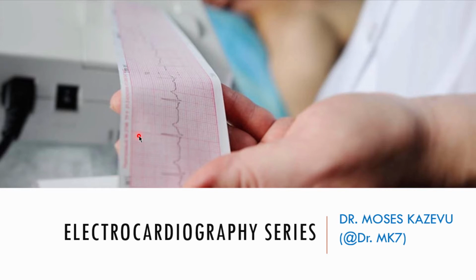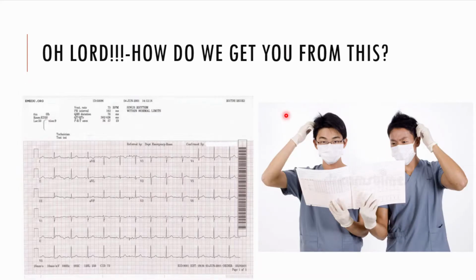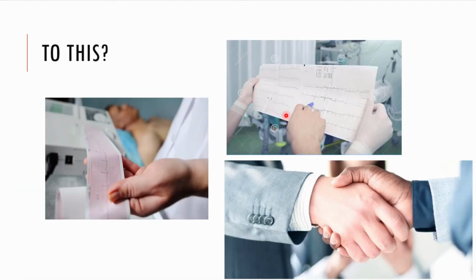We shall look at the last and indeed final lecture on the electrocardiography series. These are a series of videos that have been running that get you from being confused about the ECG to actually becoming an expert. And by this time, you should be well versed with the ECG and the common pathologies that you need to look out for, to be confident to walk on the wards, to see patients, and to make a diagnosis as a trainee as well as a health practitioner.